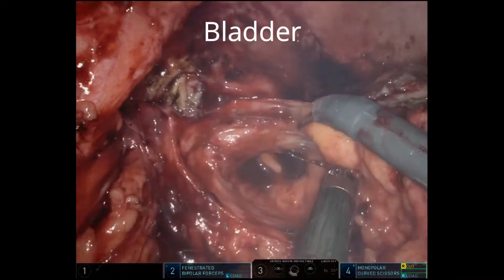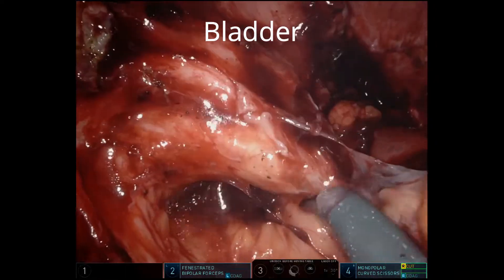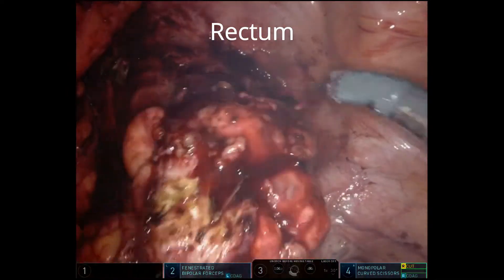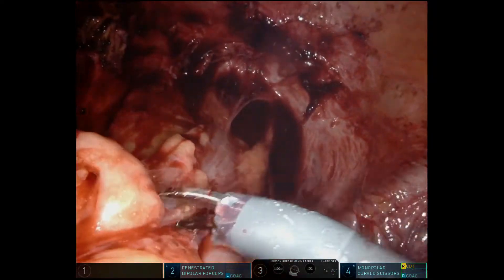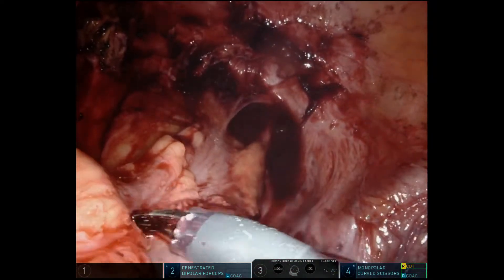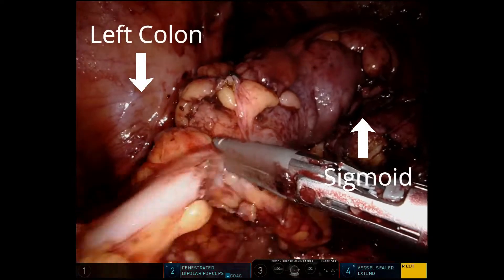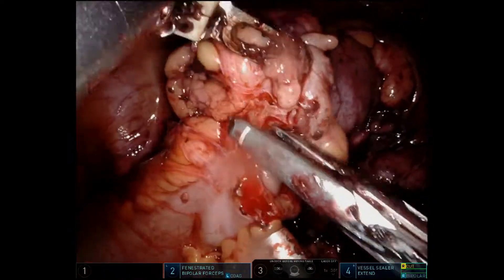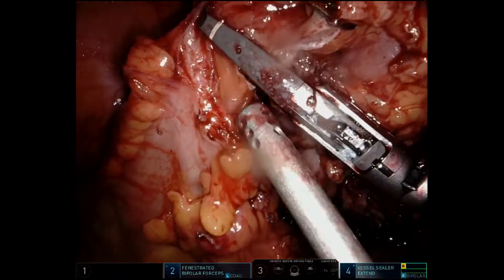Here we're taking down the disease from the left pelvic side wall and the dome of the bladder. We see the disease right there, and now we're ready to begin the resection itself. That's the rectum down there. We've already taken down the splenic flexure, which we're not going to show here. But there's the left colon and there's the sigmoid — that's where we're using for our proximal transection.